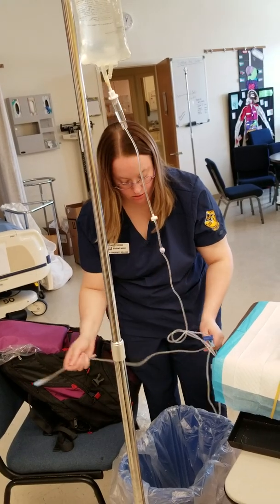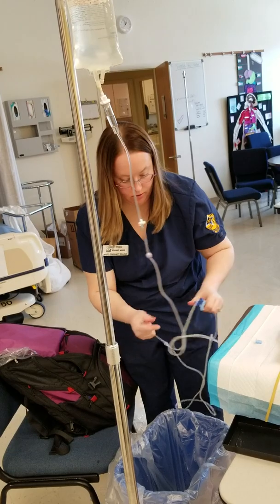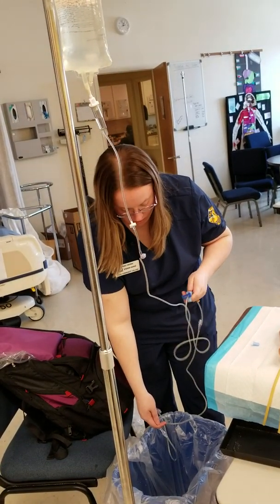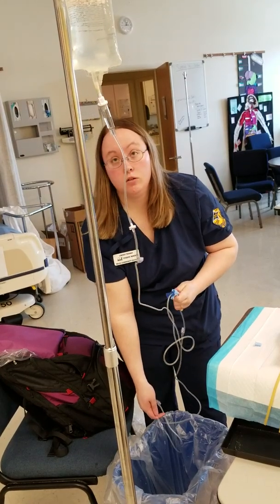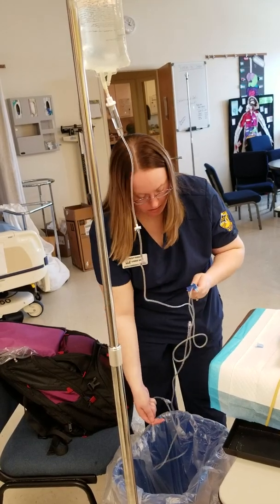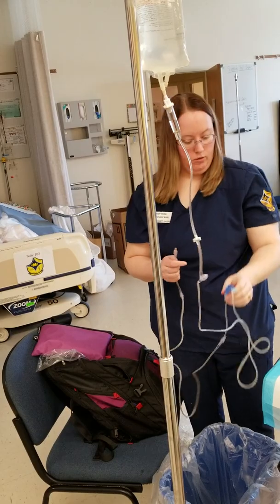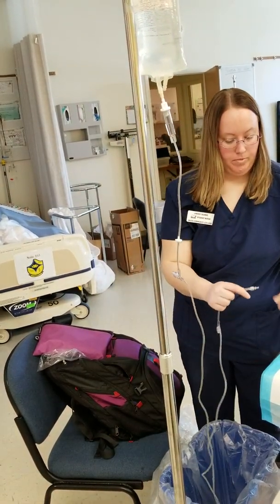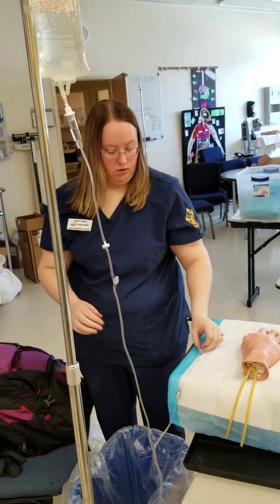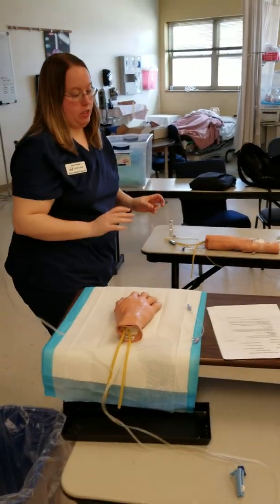Tubing, my cap to prime the tubing, making sure that there's no air bubbles. Place the cap. And I'm going to again wash my hands. Go to my patient.